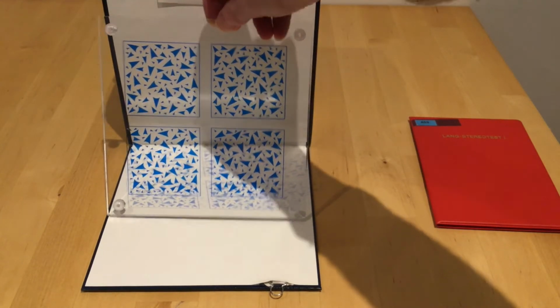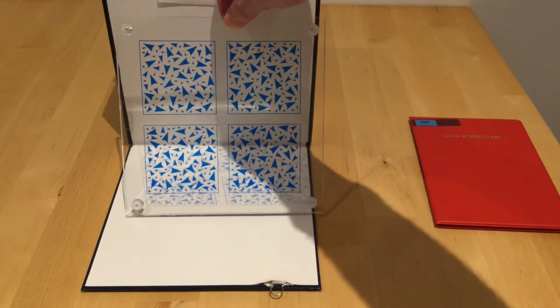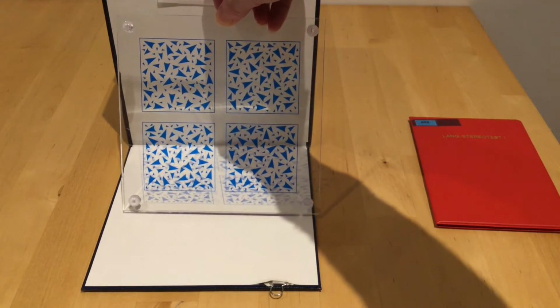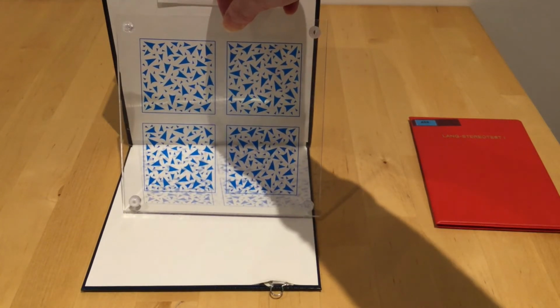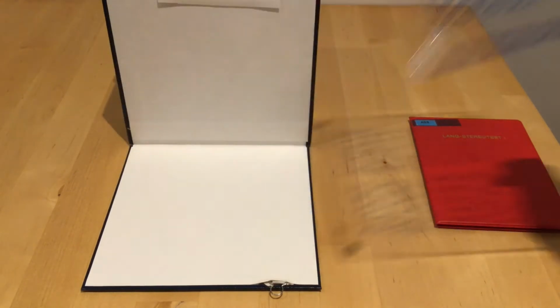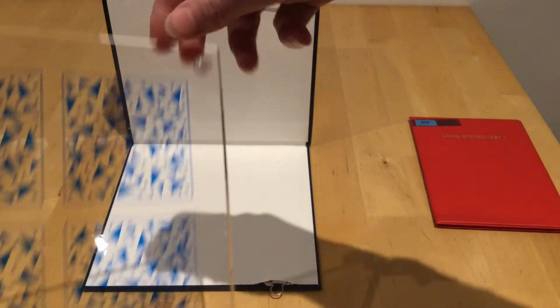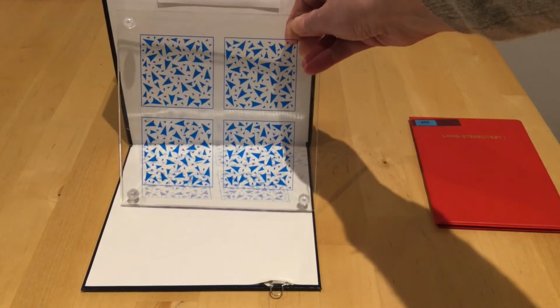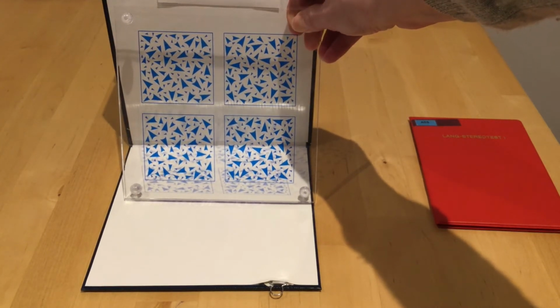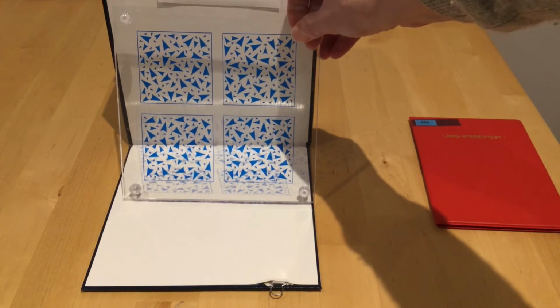So this thick plate is almost like your initial test to see if there is stereoscopic vision. You might point it out to the child first of all, or they might say, oh, there's a hole in that one. And what you do is take it away, surreptitiously turn the plate round, and then represent it and ask the child where is the circle or the hole now, and they would be able to tell you. So obviously depending on which way you orientate the plate.